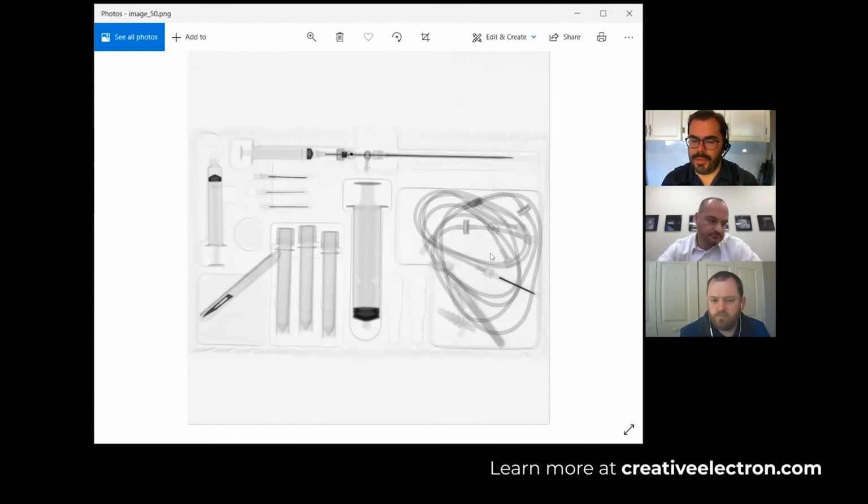Without getting too technical into X-rays, there's an effect called parallax. So things might look different in different locations, and they might portray a different shadow. So using a deep learning approach where you're feeding it information, the system is going to give us better results. You're telling the system, okay, this needle looks like this at this corner, it looks like this at this other corner, and flipped. So it starts to understand what it looks like and what it's looking for to give us better results.